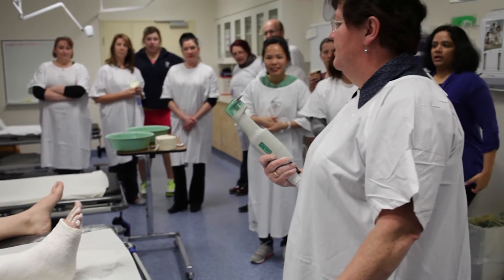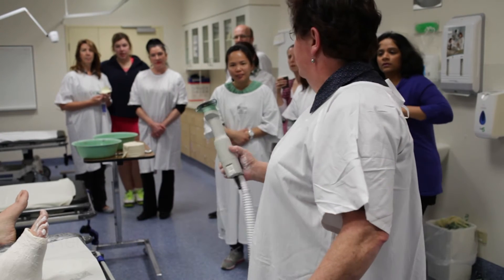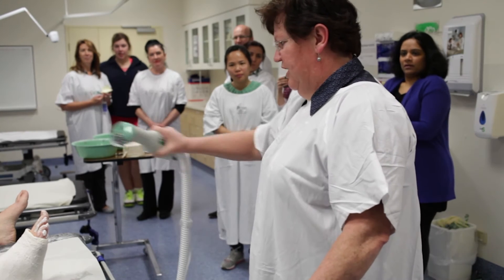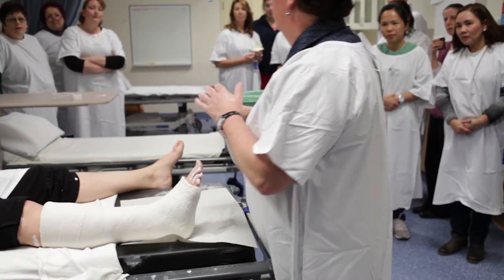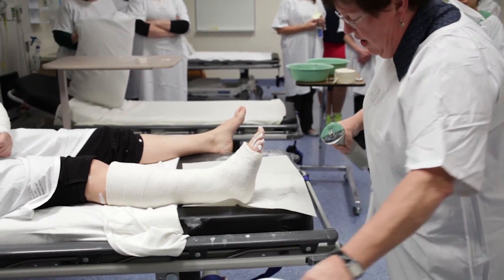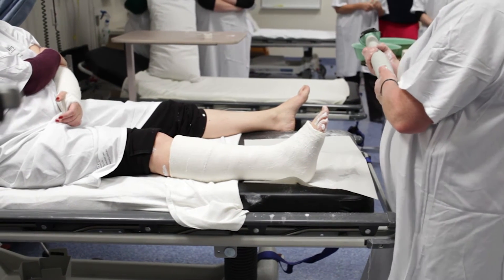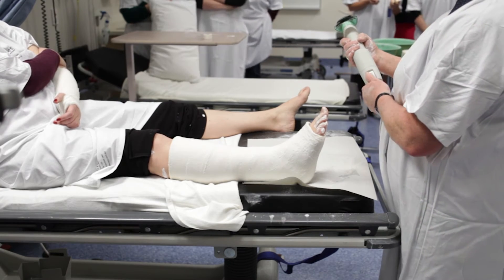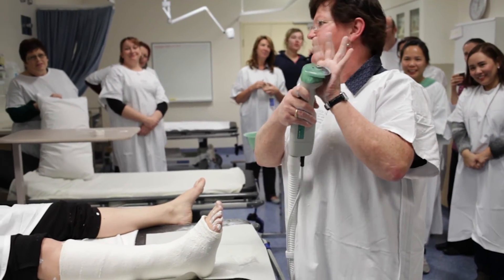The plaster saw we use to take off the plaster is a vibrating saw — it doesn't rotate. It has an encapsulated vacuum system to take away the dust. There are three simple rules with the plaster saw: don't push it up and down like that, and never leave it on the skin — it will get hot and causes friction. It vibrates; it doesn't rotate like a normal saw. It has two speeds — fast and slow. It's a magic tool; I tell the kids that all the time.